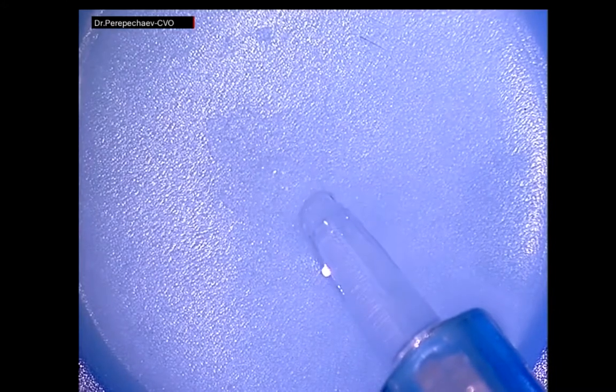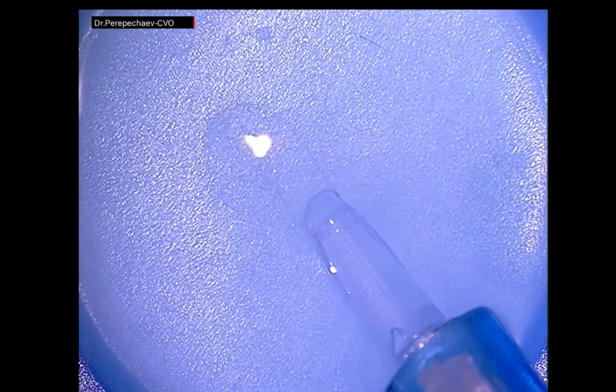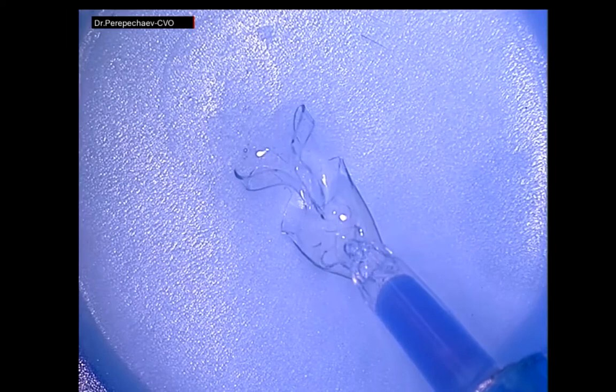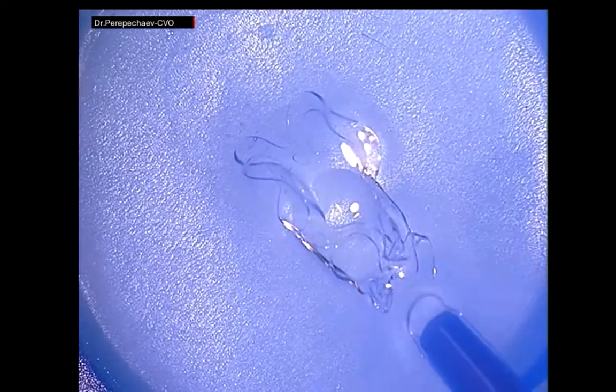Since this is a training video, we are implanting the lens in a small bath filled with saline solution. We gently press on the plunger of the injector, and we see how the viscoelastic begins to come out of the nozzle of the injector, and then the lens begins to move. It is very important to press the plunger of the injector slowly and smoothly, without stopping, in one continuous movement. If the lens is folded correctly, the implantation does not require excessive effort.